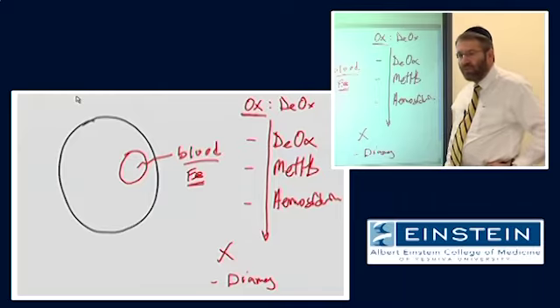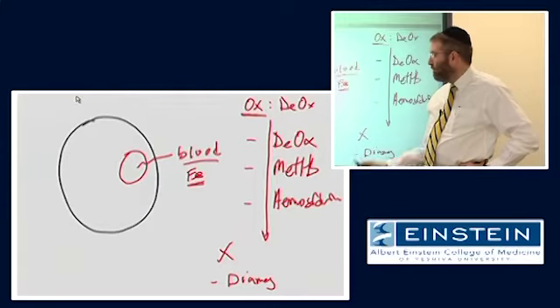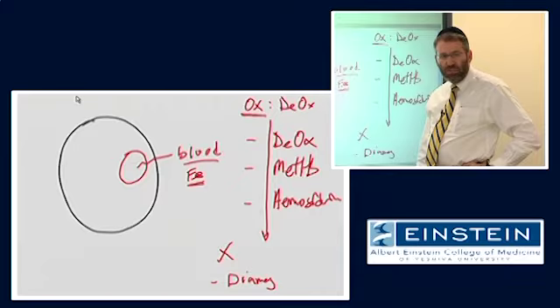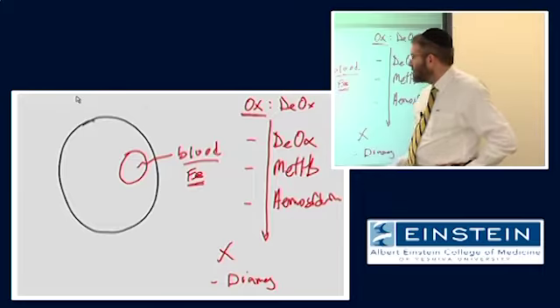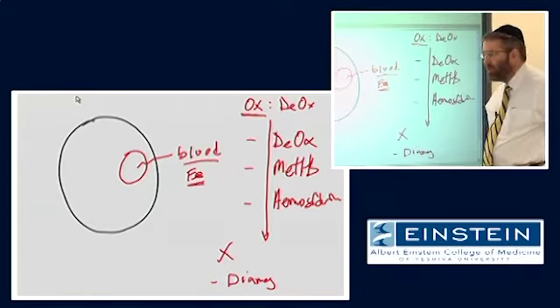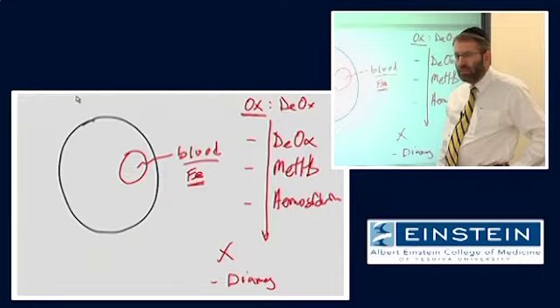And the reason for that is that the magnetic susceptibility effects of iron are shielded, or are opposed actually, by the presence of the oxygen molecules. So when you look at a region of brain where there has been a hemorrhage, if it contains oxygenated hemoglobin, you won't expect to see any of these characteristic effects.